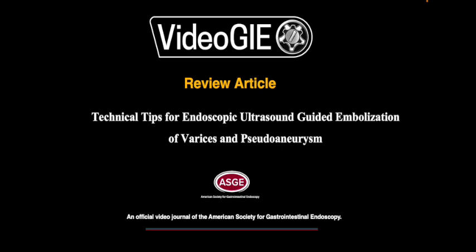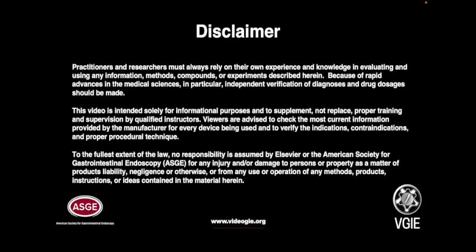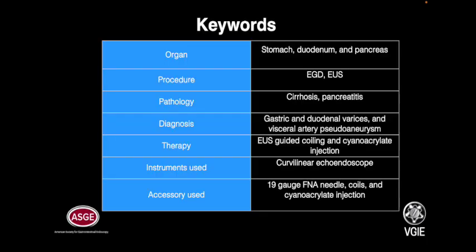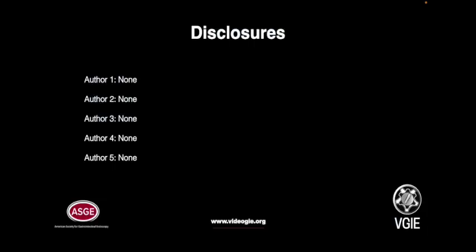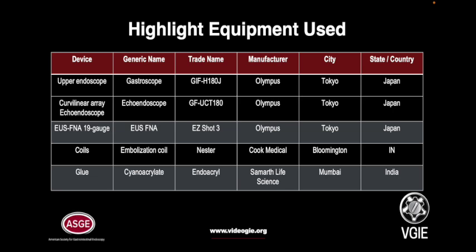Title: Technical Tips for Endoscopic Ultrasound Guided Embolization of Varices and Pseudoaneurysm. Disclaimer: these are keywords. Disclosure: none. This is a list of equipment used.